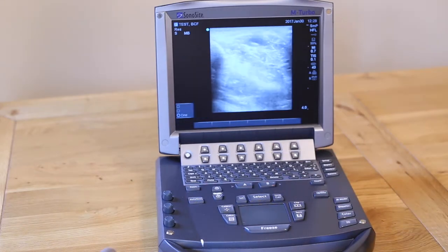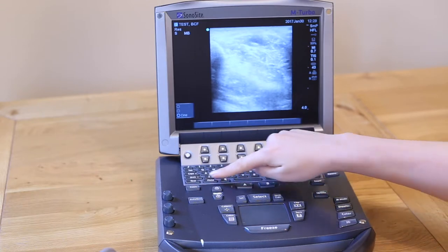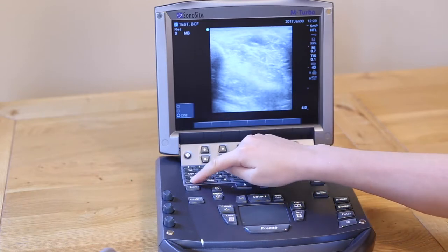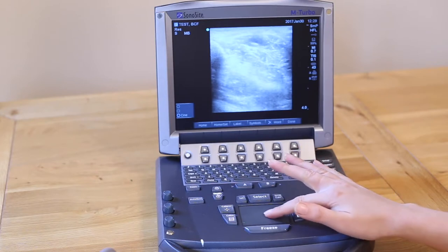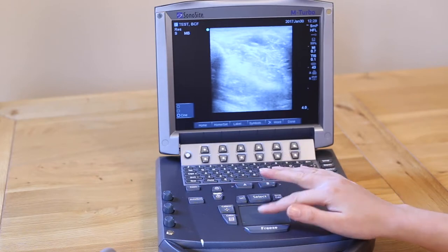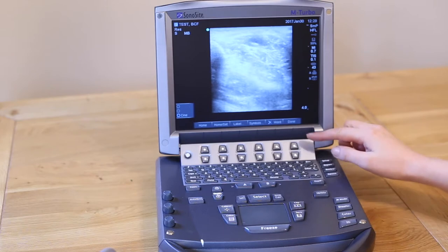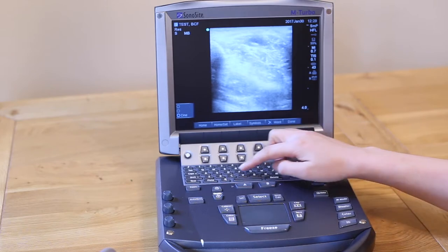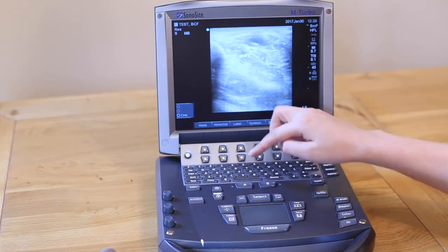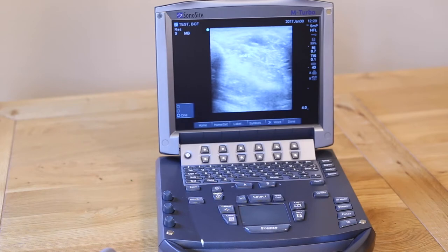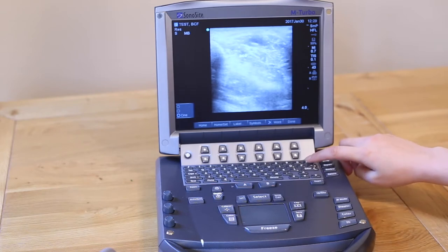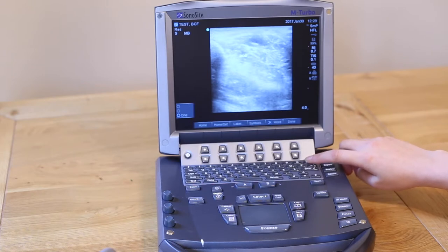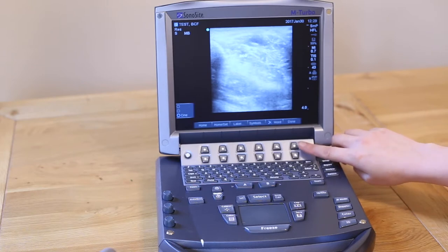There are a few different ways to add comments to a frozen image. First, press the Text button located on the bottom left-hand side of the keyboard. You can move anywhere around the screen using the trackpad and then free-type using the letters on the keyboard. You can delete a letter at a time with the Delete key on the top right of the keyboard, or you can delete a word at a time using the second soft key in from the right.